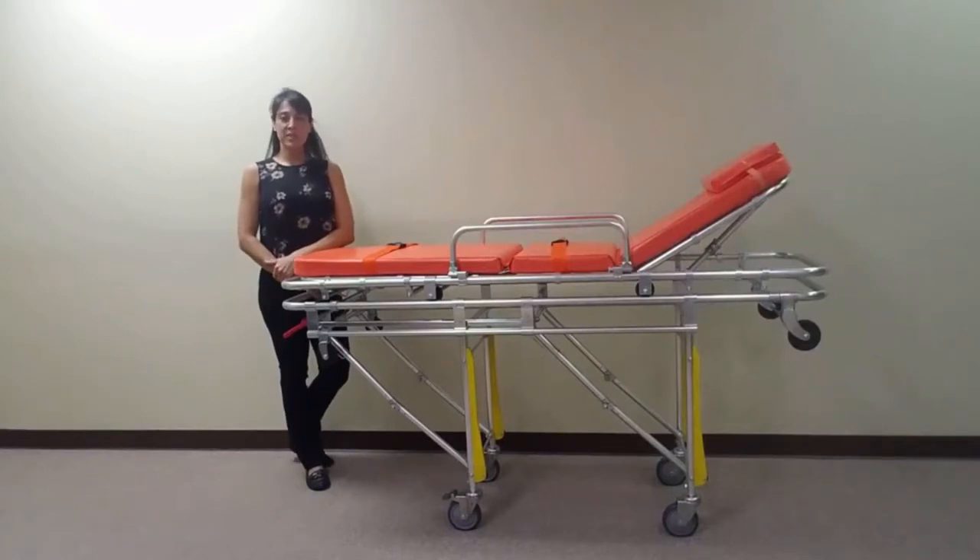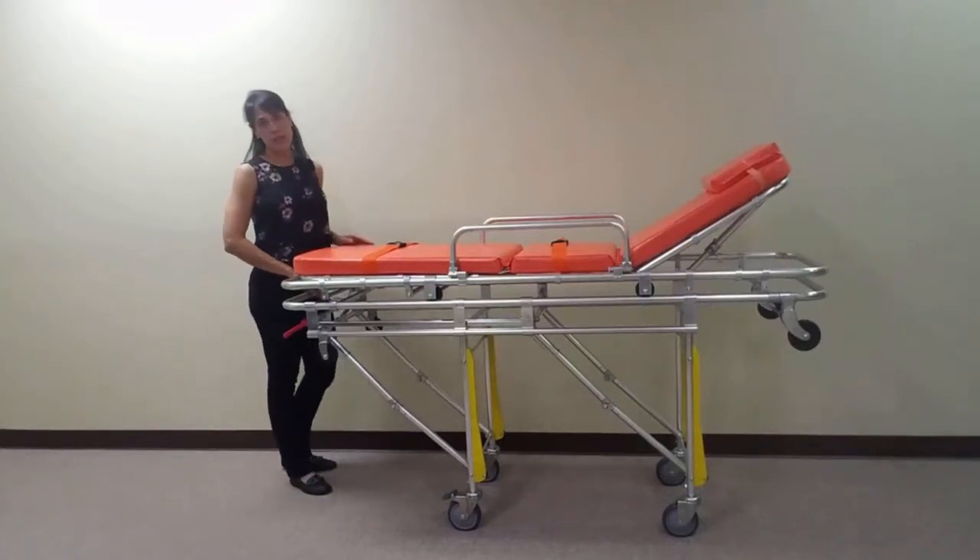The MS3C335 is equipped with a removable top cradle that can be used as a backboard to transfer or relocate your patient. To remove the cradle, push down on the red release mechanism located under the center of the foot end of the stretcher and lift the cradle off of the mainframe.